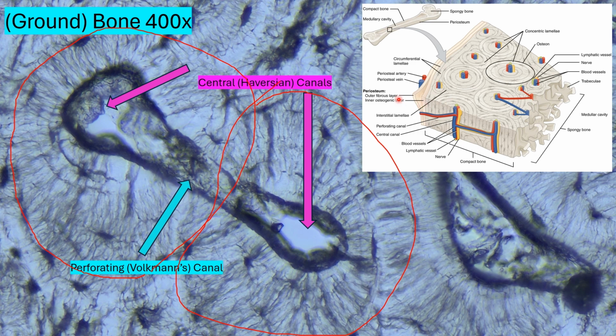So, in summary, bone is a specialized connective tissue. The main cells being osteocytes, although there are a couple others that are not mentioned here, and the extracellular matrix, which is comprised of embedded collagen fibers, although not easily seen in the slide preparation, and those fibers are surrounded by a mineralized hydroxyapatite with the mentioned patterns, and it has both blood and nerve supply. So again, specialized cells and specialized extracellular matrix.